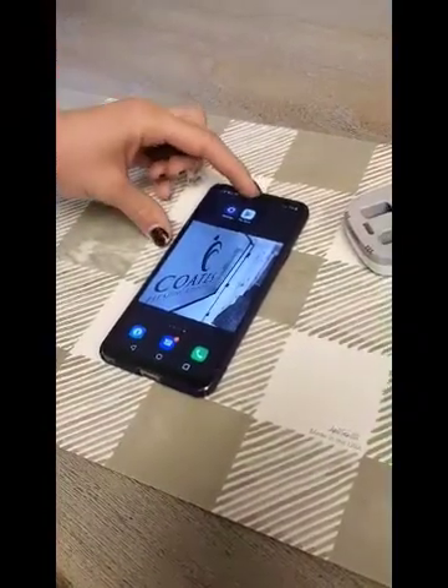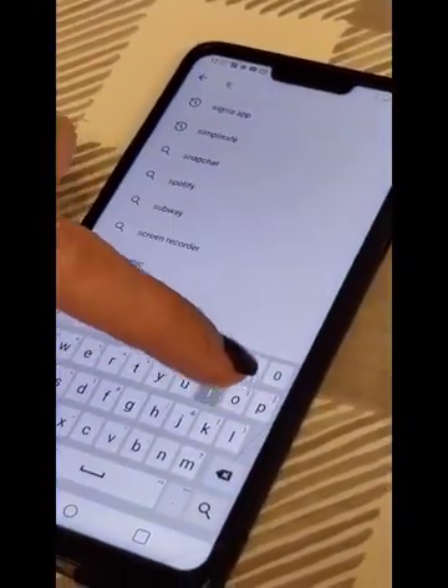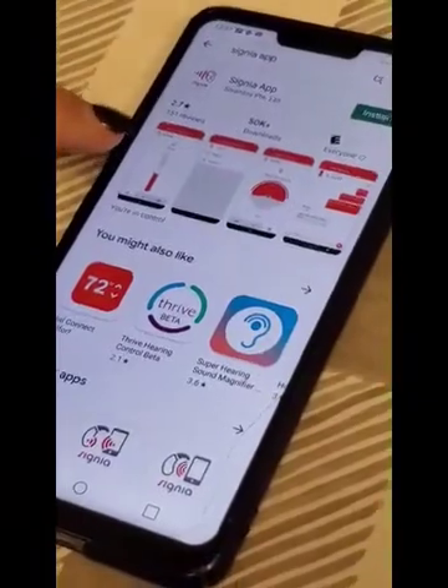You're going to go to your Google Play Store or the iPhone App Store. You're going to search for Signia — that's S-I-G-N-I-A. You'll see it pop up here. It looks like this, the Signia app.